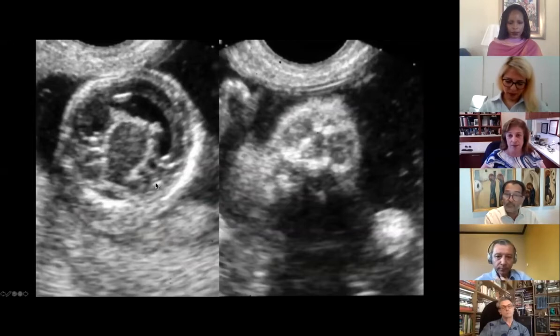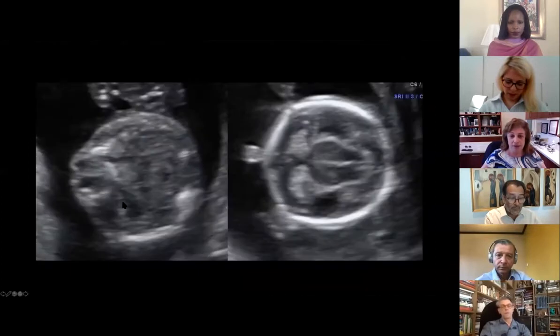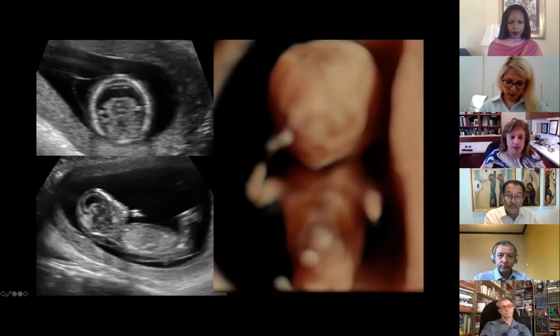And here's an example of hypotelorism and holoprosencephaly, with the eyes too close together. The proboscis is up above the head, above the eyes, and we have holoprosencephaly evidence right there. So these are eye abnormalities. We've moved on from the mandible to the eyes, and here again you can see how the eyes are too close together in this fetus who has trisomy 13, holoprosencephaly, and a big central cleft and hypotelorism.